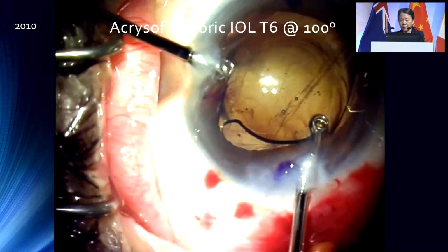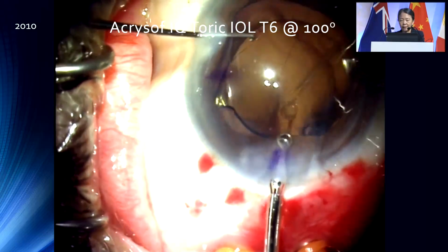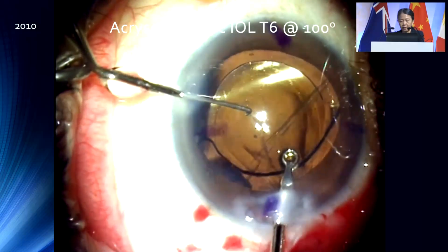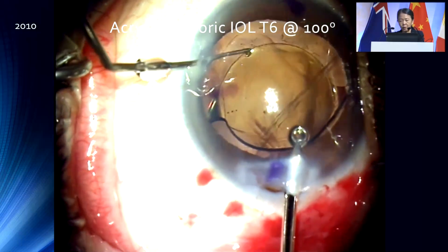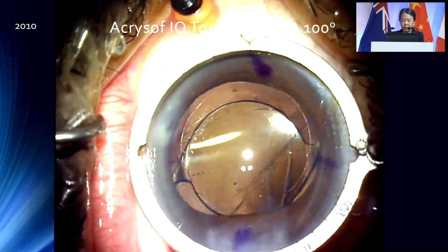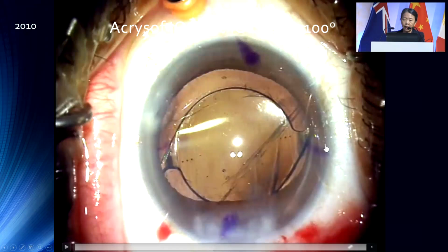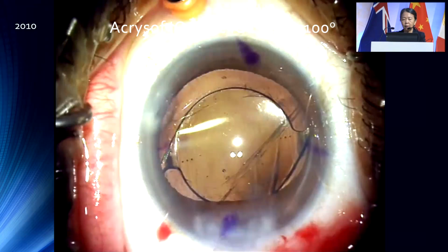I think this is probably one of the few cases that were being done on toric lenses that had a PCR like this with a drop fragment. I looked at the alignment, no, it wasn't good, so I redid it, but you can see I'm using lens grasping forceps that don't permanently mark the optic. Once I am happy with the correct alignment, which are not these marks here, I checked it with the toric ring, then I leave it there and optic capture it. Even after optic capture, you can uncapture it by holding it with the forceps and adjusting its position to a deeper plane, and then you can rotate and then lift it forward again.